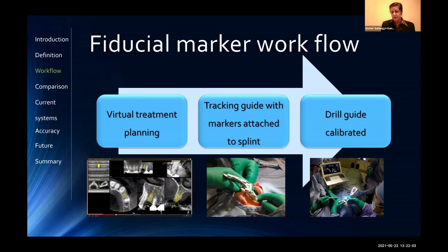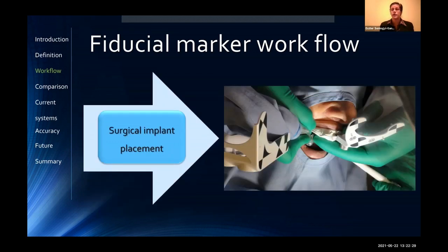You see that here the drill guide actually has this little handle, again with the black and white markers. And you can see that the patient has this, I just used to call it Mickey Mouse. I don't know why, because it kind of looks like it has 2 ears. But so it has this other marker attached to the patient's mouth. We calibrated. Calibration usually takes less than a minute. It's just a wrist movement. And we are ready for surgery.